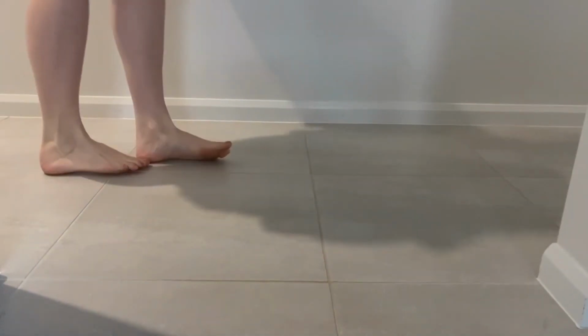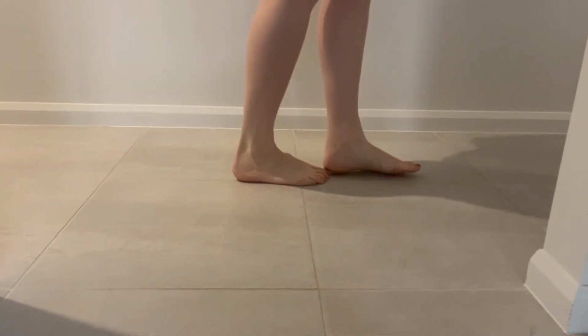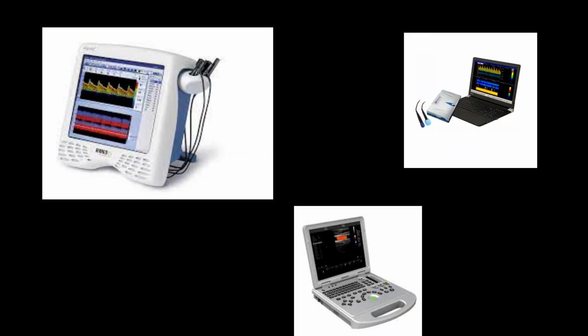Slight deviation on the tandem walk was identified. There were nil other abnormalities noted during this assessment. Transcranial Doppler ultrasound can be complementary to the comprehensive neurological assessment. It provides accurate real-time information, is portable, low cost, and non-invasive.